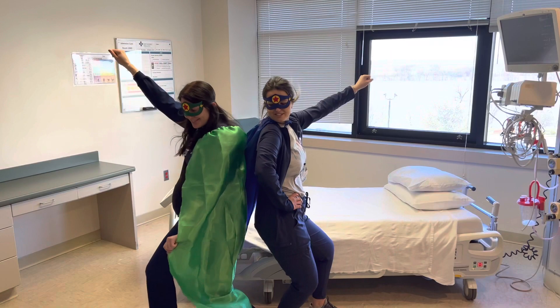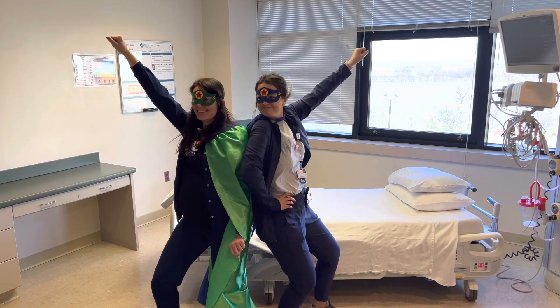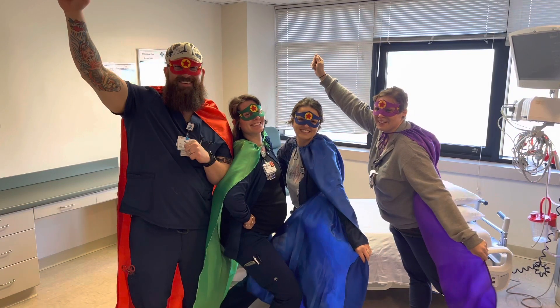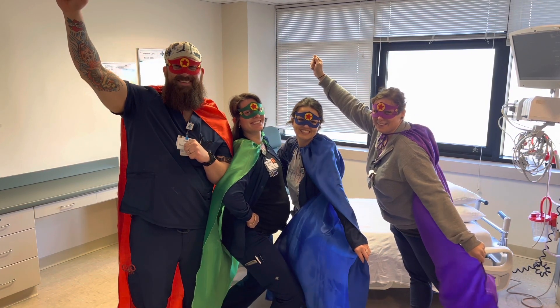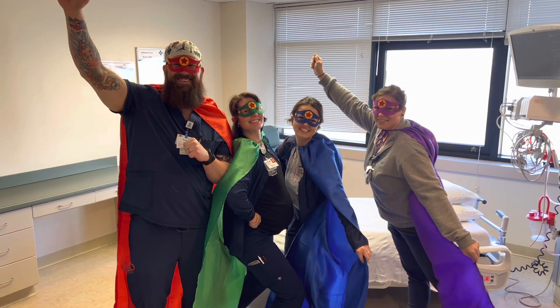By default, our policy is that two trained staff are required to insert a Foley to confirm aseptic insertion. But in reality, you're going to need more hands than this to help hold legs and position the patient. So play it safe and get more help rather than risk a contaminated insertion.